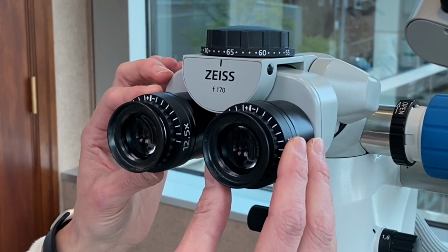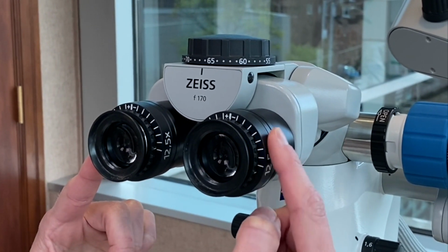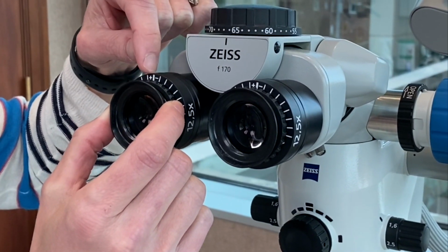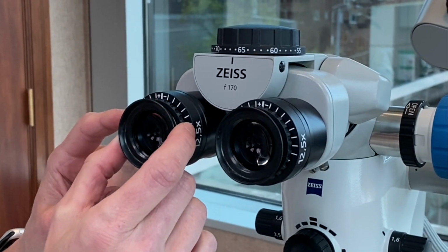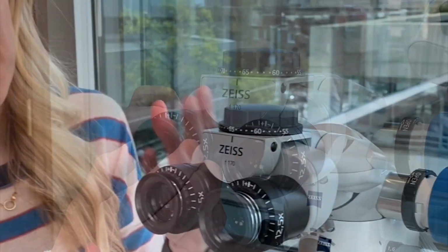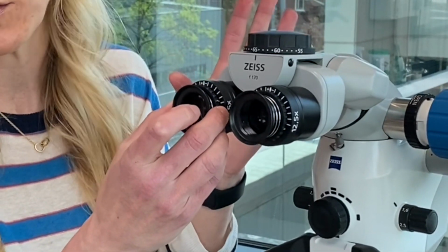All right, let's talk about the eyepieces. Each of these has a lens in them. On this scope, it's a 12.5. The number is usually on the side of the scope here. These can go anywhere from a 10 to a 20, and that is a fixed lens. On top of each of these, you can see these little hash marks and this plus and minus. These are the diopter adjustments, and they go from a -8 all the way up to a +5. These are dialed for anybody who needs some corrective refraction in their vision. Somebody who has perfect vision would have both of these set at 0. I, on the other hand, have one eye that is just slightly different, so I would adjust this eyepiece on the left to fit my prescription, which is a 1.25 on my left eye.